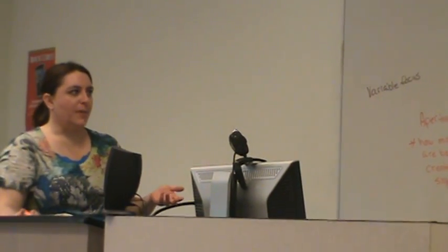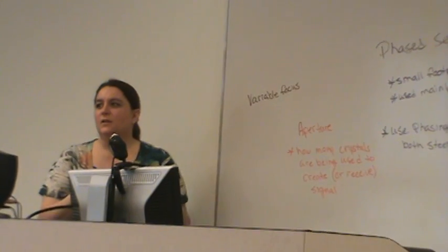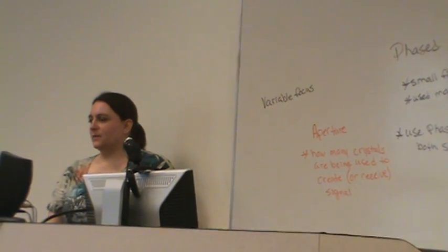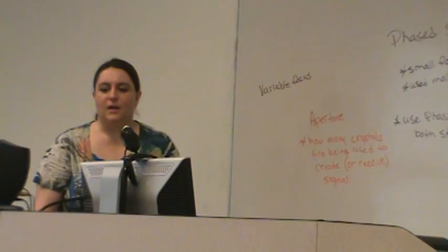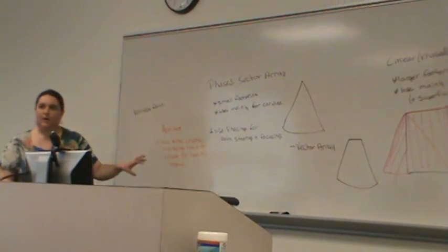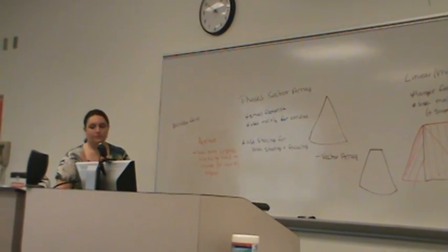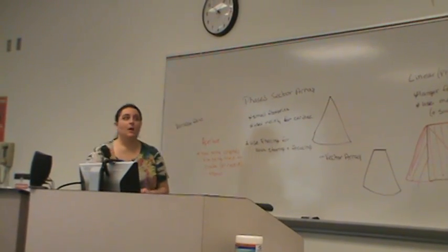But they'll often talk about aperture and dynamic aperture sometimes, and we kind of skipped over it in your book, but it's in there. He talks about dynamic apertures, meaning that we can use different crystals to receive than we did to send. So it's just a way to turn crystals on and off to change how the beam is responding. That's the idea. It's not anything that they ask a ton of questions about, but just so you at least heard the word and can relate it back to something that they're using it for.